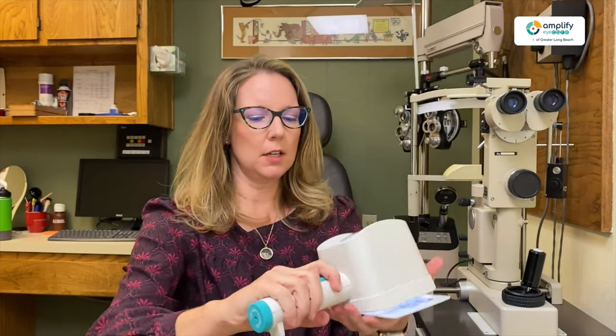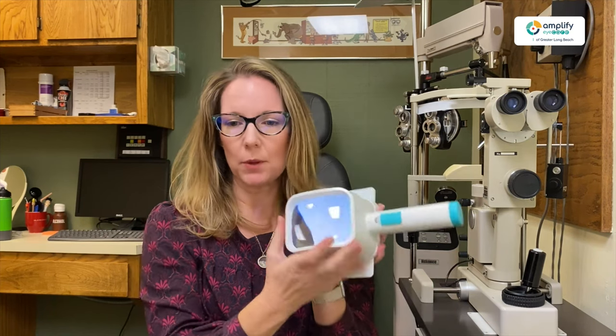This is also a 2.5 times magnification, so we have a nice big window. When they get into higher magnification, you have a smaller window for that purpose. But we can get into that a little bit later.